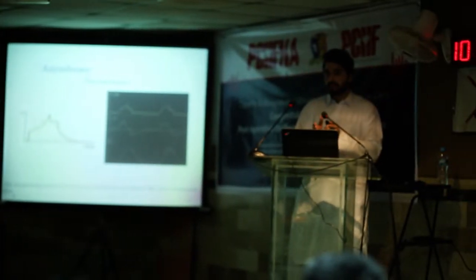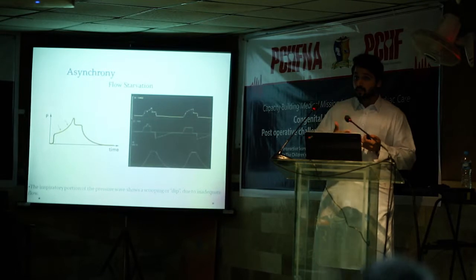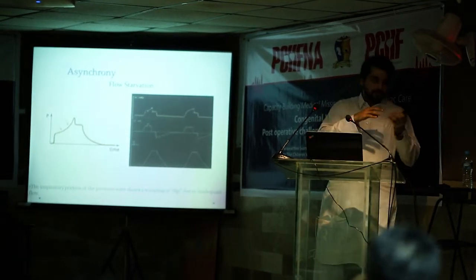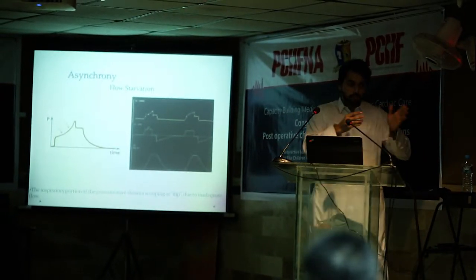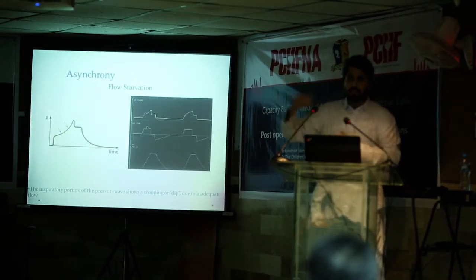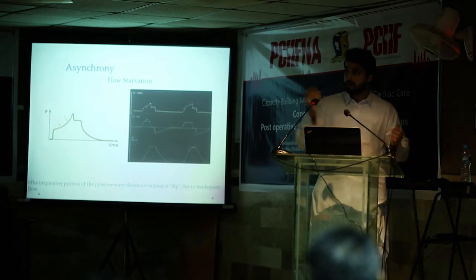So again, before I go to complications, if you know troubleshooting, you can help the patient, you can give him more comfort, you can facilitate faster weaning of the patient because he's synchronizing, or you can fix the air trapping, whatever the problem. But if you don't troubleshoot, you don't know what the problem is, right? So no one is aware of the problem. So the problem may complicate and may cause pneumothorax, for example, air trapping, one of the most common causes of pneumothorax.